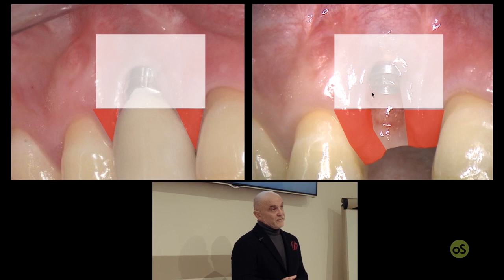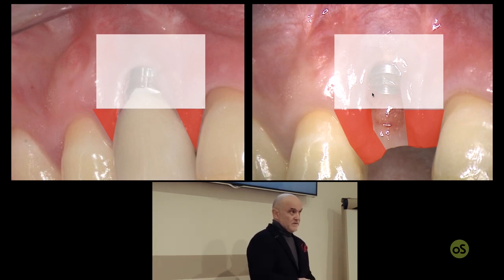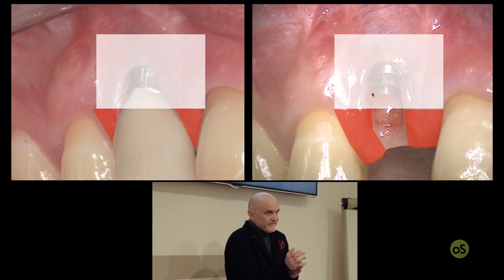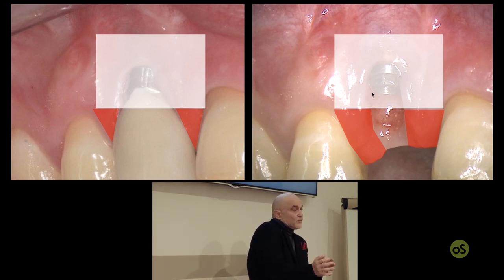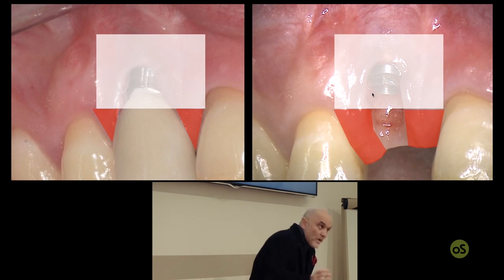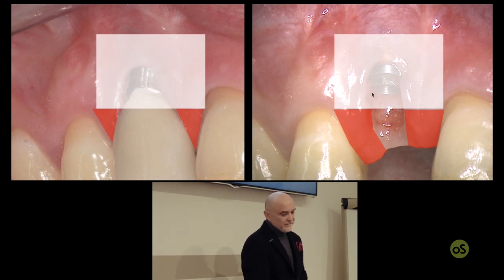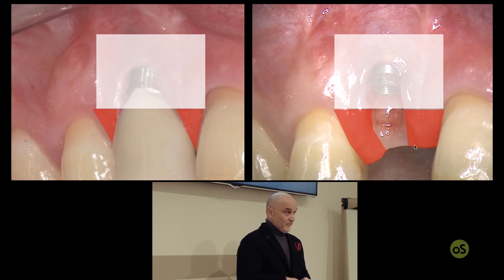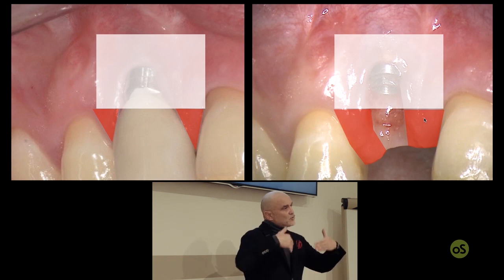It's not only a surgical procedure. Patient comes, the crown is removed, the abutment is changed, a temporary crown is applied, a cemented temporary crown, so you can remove it. If there is a space that the soft tissue still has to fill, you reduce it even more, you wait 1 more month so that the soft tissue is now intact and completely filling the space previously occupied by the crown, previously occupied by the whole abutment, and now you can perform a surgical procedure with an enormous amount of blood supply for your surgical papilla.